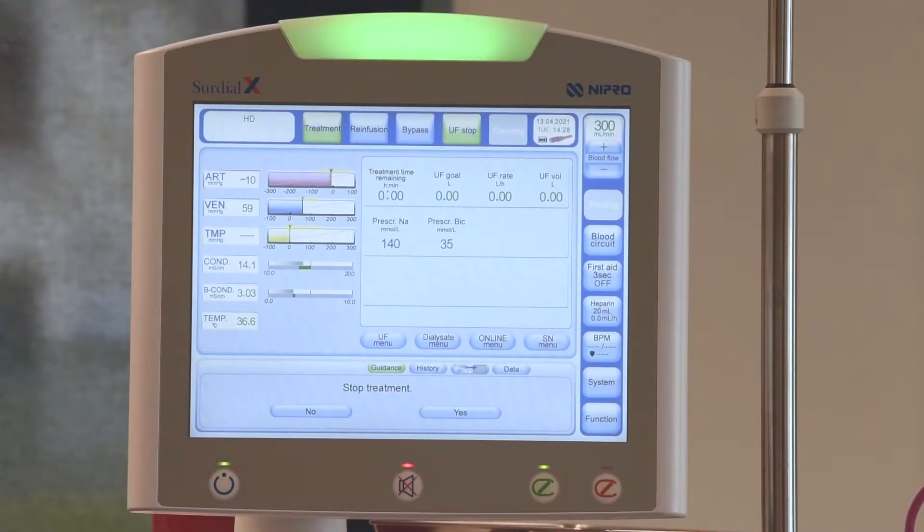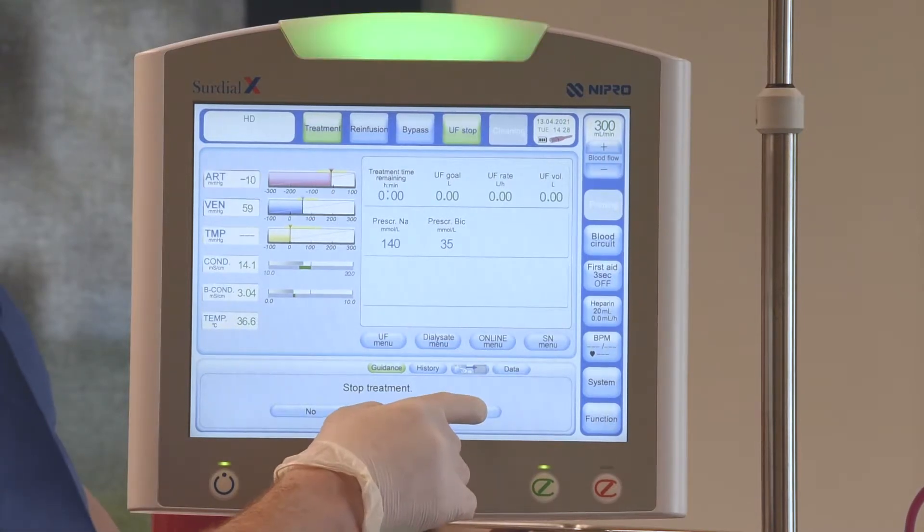Once the treatment time is up, CERDUALX will play a melody to inform the user. Please follow the screen prompts to end the treatment.